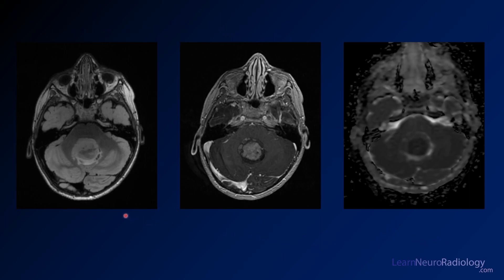Looking at our images: on the FLAIR we have a mass in the fourth ventricle, completely effacing the fourth ventricle — it's very hard on this image to tell where it's arising from. On the post-contrast you have some solidly enhancing components in the center, maybe some less enhancing components around the margins. On the ADC you can clearly see pretty low diffusion values, certainly lower than the adjacent brain stem and cerebellar hemisphere.